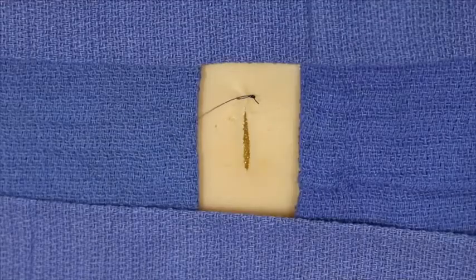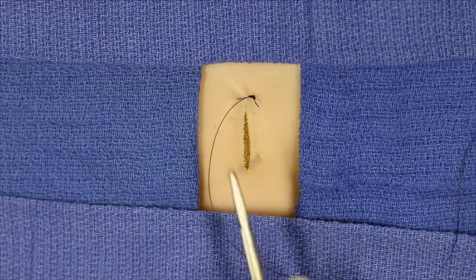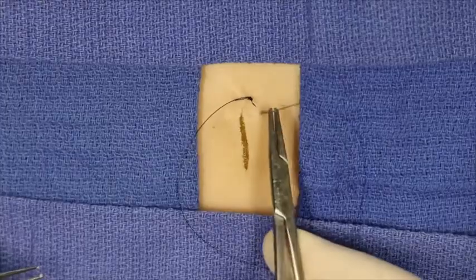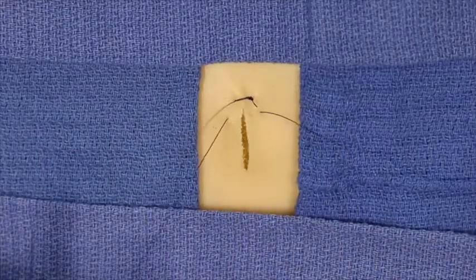At this point the needle is reloaded and the horizontal mattress component has begun. The needle is inserted at 90 degrees, exiting on the contralateral side. The needle is passed through.